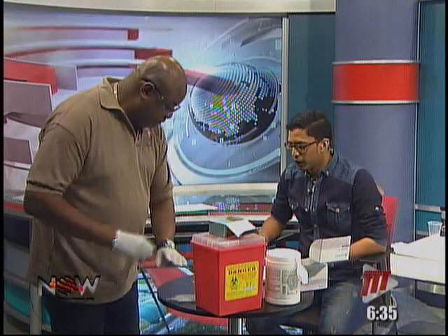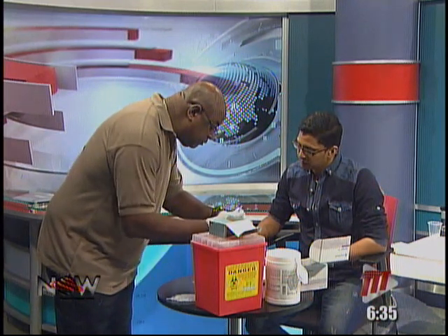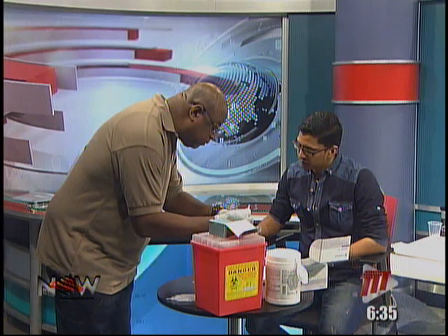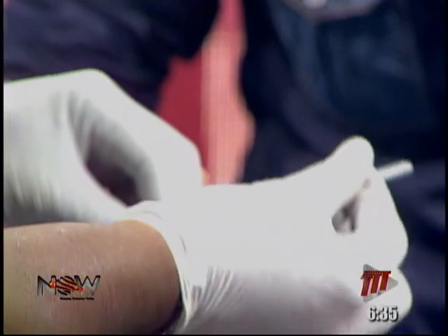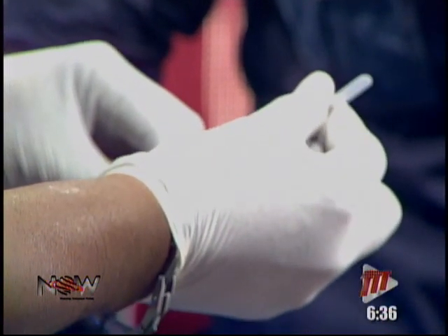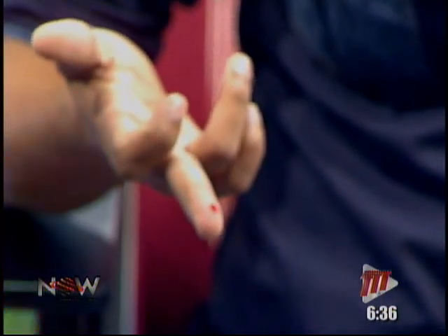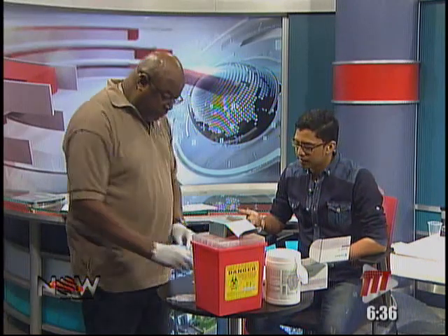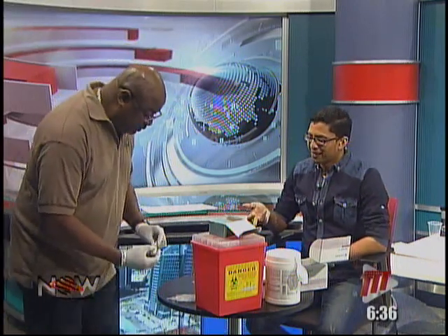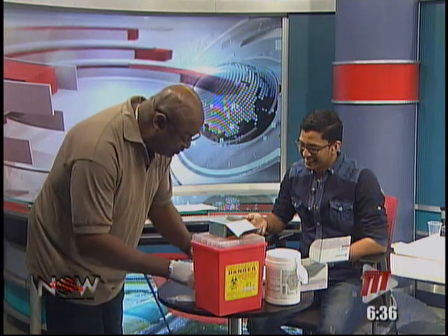Okay. Nice. So you put the blood there, and we use 2. And how long does this take? 15 minutes for the results. So I have 15 long minutes to wait. 15 minutes to wait for the results.